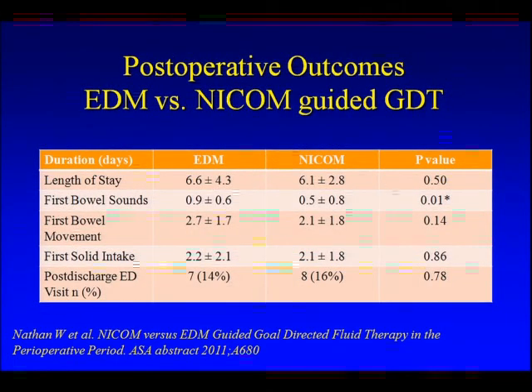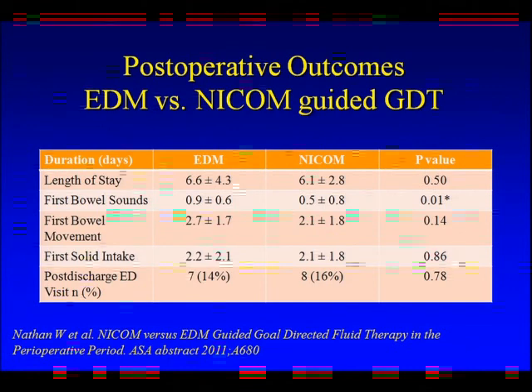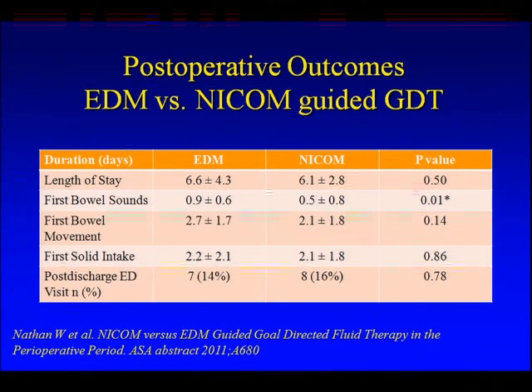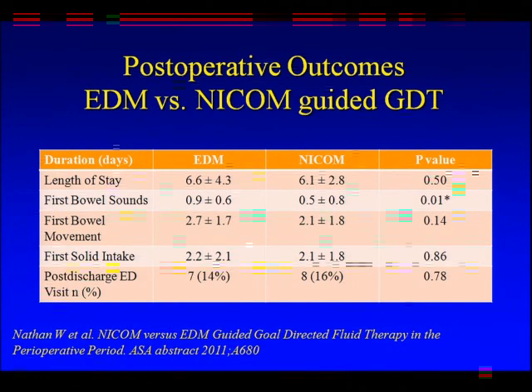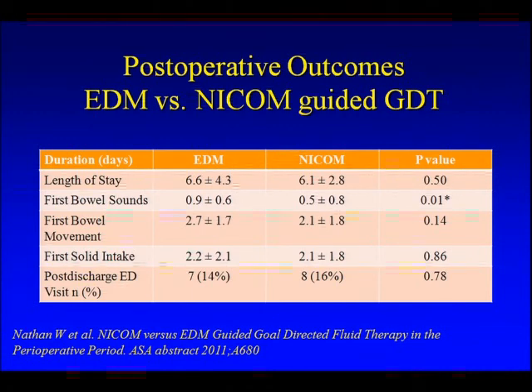Now, I show this really not to suggest that one monitor is better than the other, but just to show the length of stay. As we had previously shown that goal-directed therapy with esophageal Doppler was able to reduce the length of stay, we were again able to show that there was really no difference in length of stay with NICOM. Interestingly, if anything, patients in the NICOM group had an earlier return of bowel sounds compared to the esophageal Doppler group. But again, this is not the primary analysis, and therefore I would not concentrate on these slight differences.